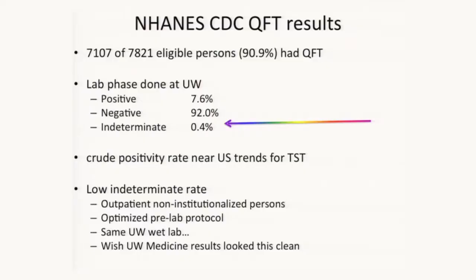So, there's nothing wrong that we're doing in our lab that's leading to this. It's really the pre-lab phase, patient selection and phlebotomy side. This overall positivity rate was really near the US trends. And we wish our results could look this clean.